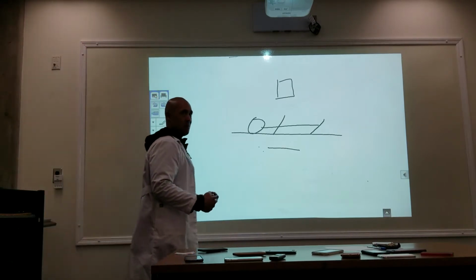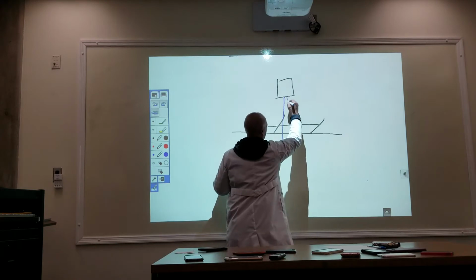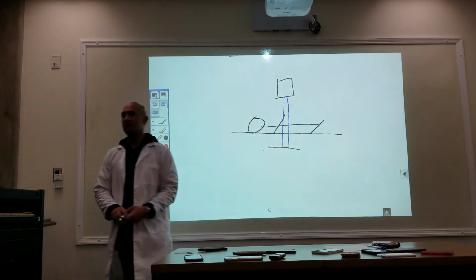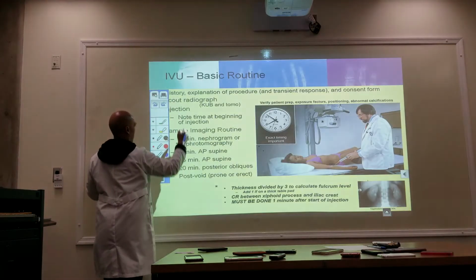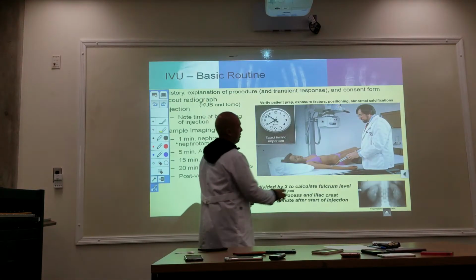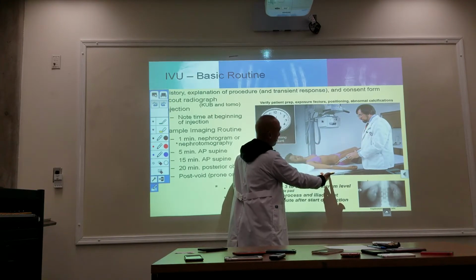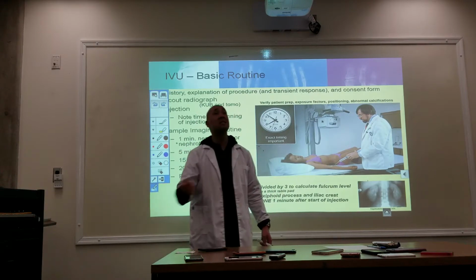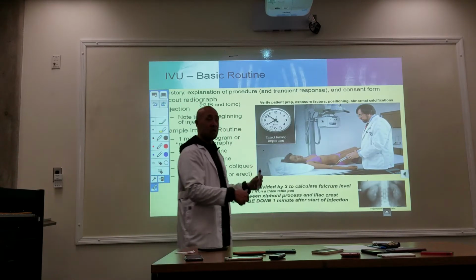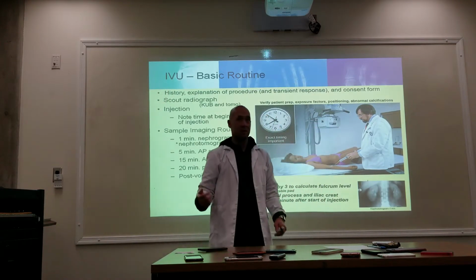We connect the X-ray tube to the Bucky. So if you look back over here at this image, this X-ray tube is locked into the table Bucky. We have control of that. We can engage it, we can disengage it.